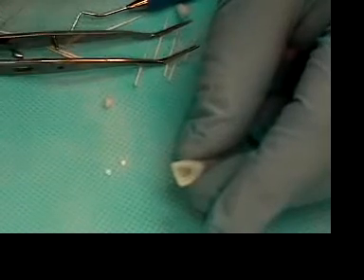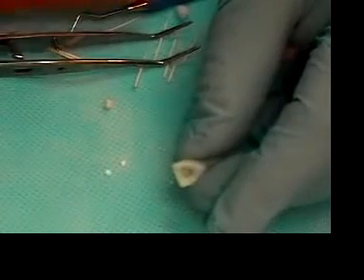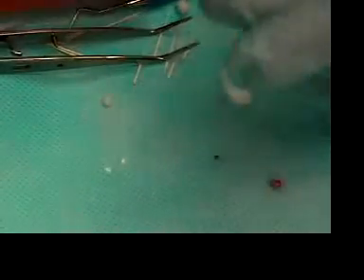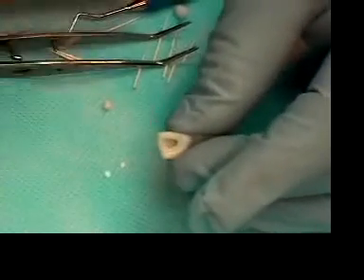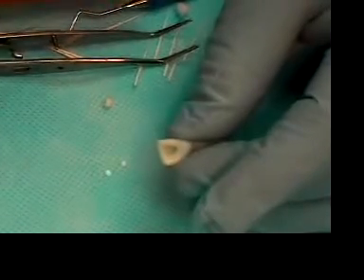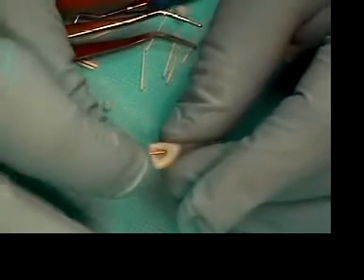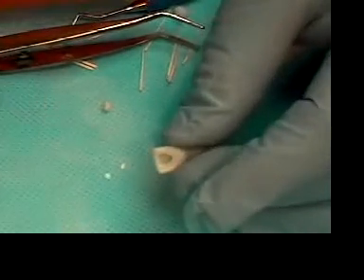Once it's dry, you want to take your patency again. Check your patency with your patency file, which is either the 8 or the 10. Then you want to make sure that you haven't plugged the debris, so use your master apical file, which is a 30, and just clean that out once more to make sure there isn't any debris.